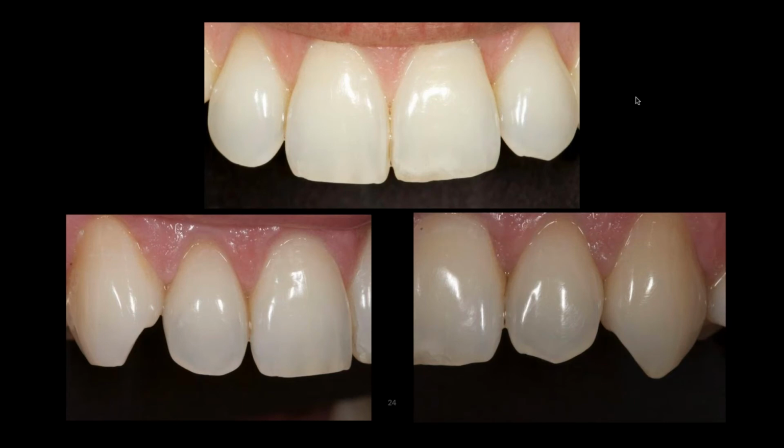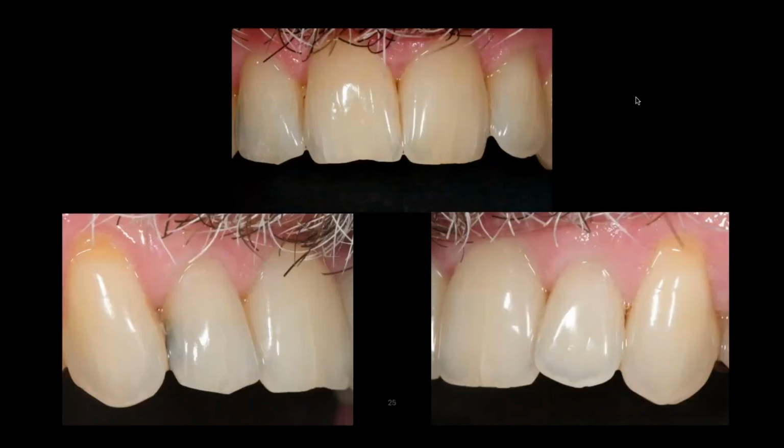So you could go from a 3M1 to a 2M1, and there goes the ball game. So you can take good pictures, transmitting them over the internet. If you're doing big cases, that's fine. If you're trying to match a single central, that becomes an issue. I don't think you can get close, but not perfect.